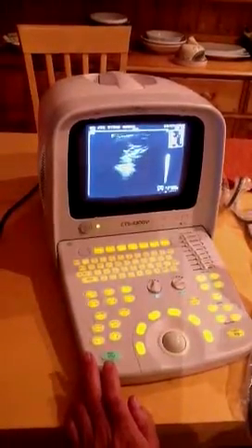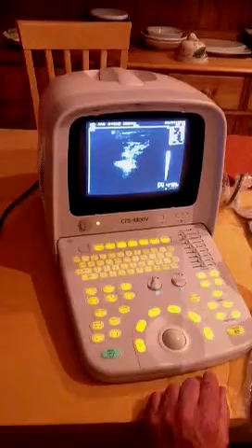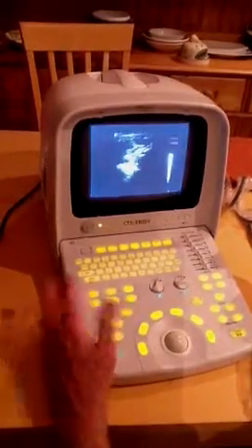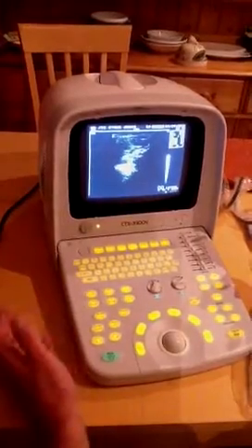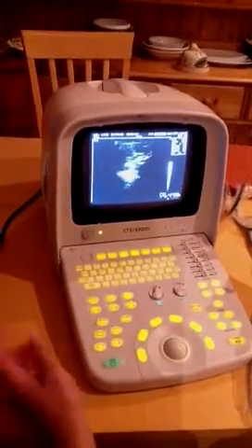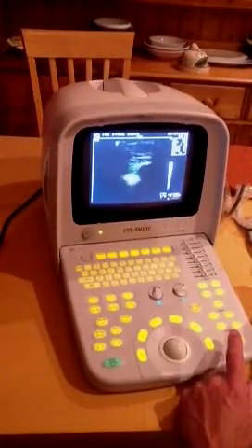You also have the facility to store images on a cine loop — it's very simple to do. You just press the freeze button, then press cine, and you can see it trawling back through the last number of frames. It stores 60 frames. To get out of that, you just press the freeze button again and you're back to the live image.